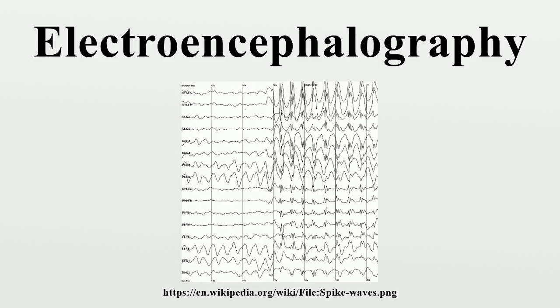The electric potential generated by an individual neuron is far too small to be picked up by EEG or MEG. EEG activity therefore always reflects the summation of the synchronous activity of thousands or millions of neurons that have similar spatial orientation. If the cells do not have similar spatial orientation, their ions do not line up and create waves to be detected. Pyramidal neurons of the cortex are thought to produce the most EEG signal because they are well aligned and fire together. Because voltage fields fall off with the square of distance, activity from deep sources is more difficult to detect than currents near the skull.